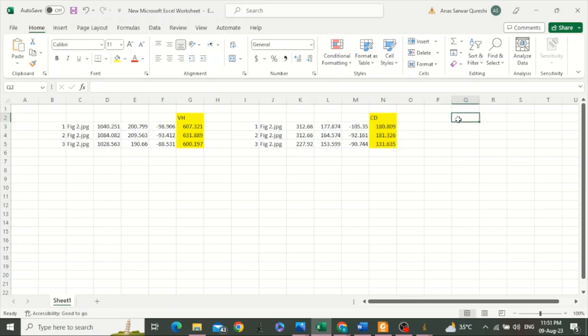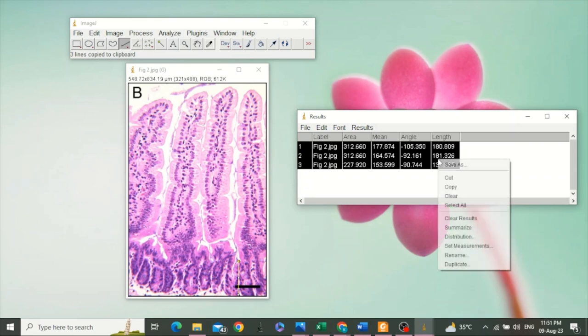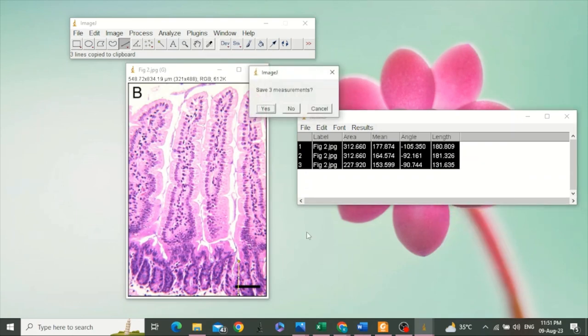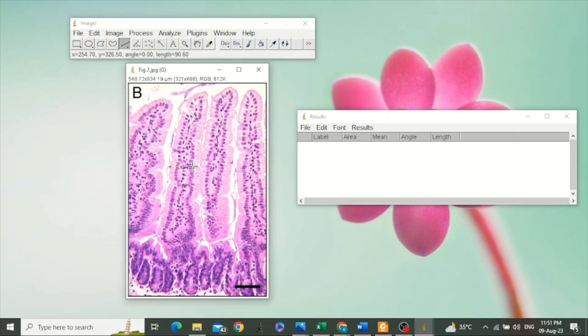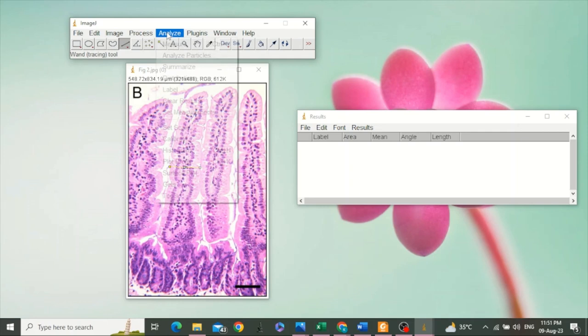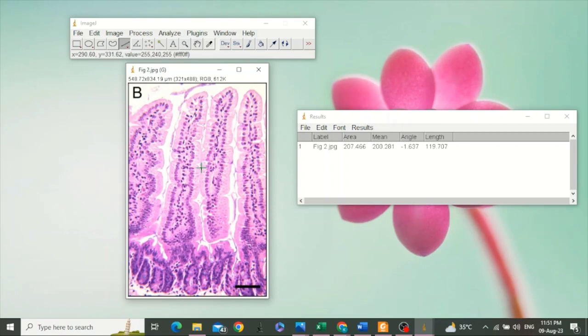The next thing will be villus width. First, clear these results. The width is measured at the middle part of the villus. Draw a line, go to Analyze, select Measure. This is the second measurement.